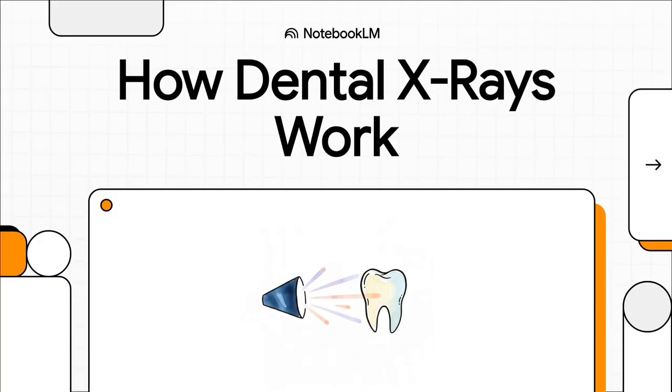All right, you know the drill, right? You're sitting back in the dentist chair, they throw that heavy lead apron over you, and then they swing this weird cone-shaped machine right up to your jaw. There's a little beep, and poof, it's done.